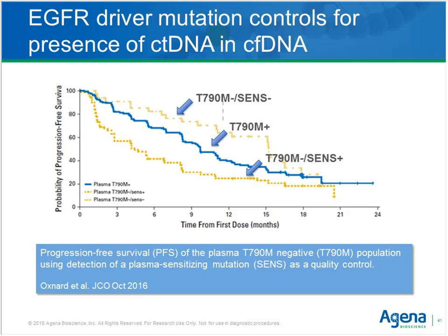that simply means that there was no ctDNA detectable in these patients. So T790M being negative can mean it is negative but there is ctDNA, or it is negative because there's no ctDNA. The paper cited at the bottom gives you more detail on these facts, and there are a number of other papers working on the necessity of interrogating a larger panel of mutations at the same time.